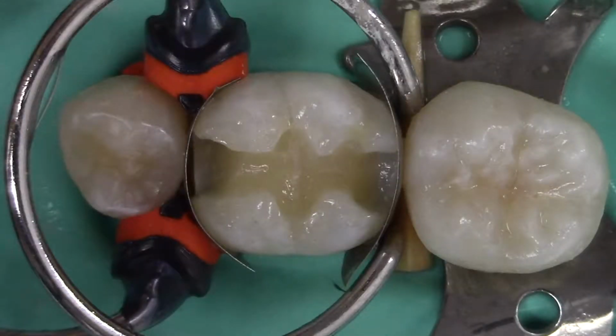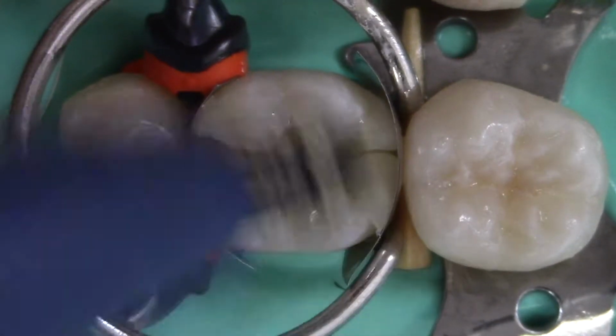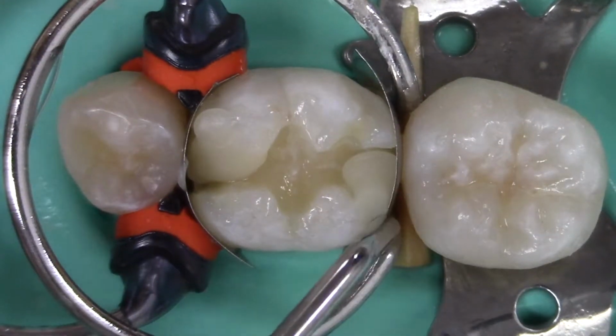We are now ready to fill the preparation. In this technique, the marginal ridges are formed first, and then the remainder of the occlusal surface is filled, turning a Class II into a Class I. A small amount of composite is injected or placed into the mesial and distal box. It is important to visualize the placement of this composite and ensure that the composite completely adapts to the bottom of the box.